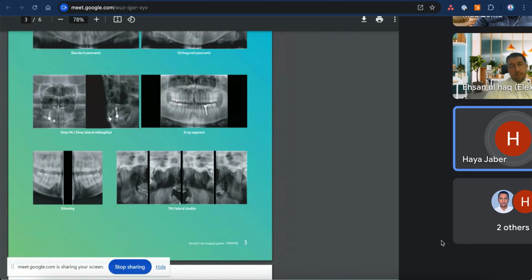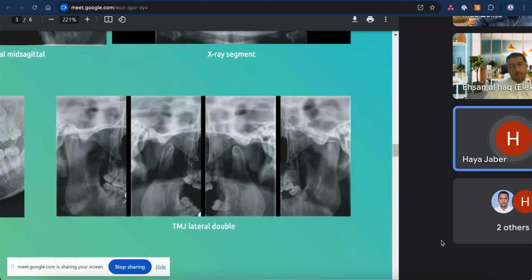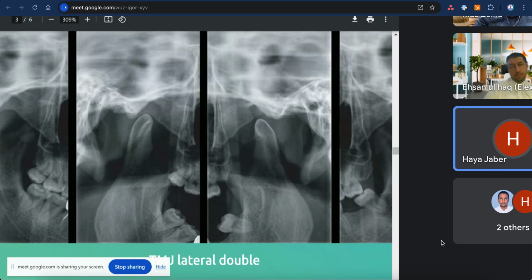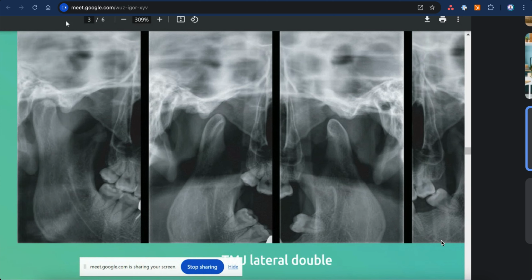Oh, this is TMJ lateral double. Okay, TMJ. What is the double? I take it from the right and left side, both. This one is from the right side, but I can have the double here, the right side and the left side all on one screen. So I can exactly differentiate what changes are happening in the TMJ, which is the condyle. We have a condyle in the face, beside your ear.